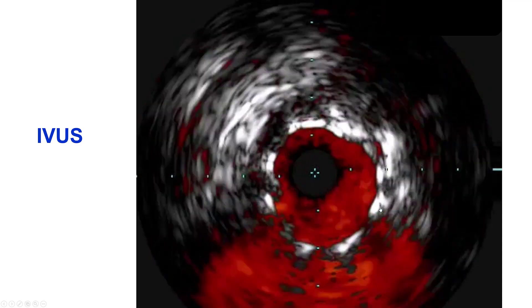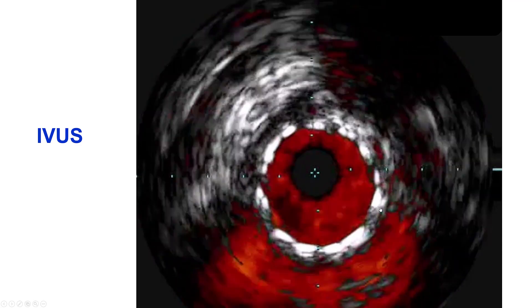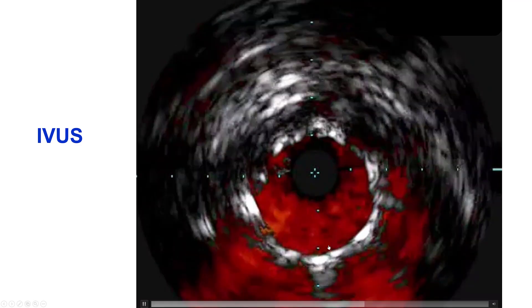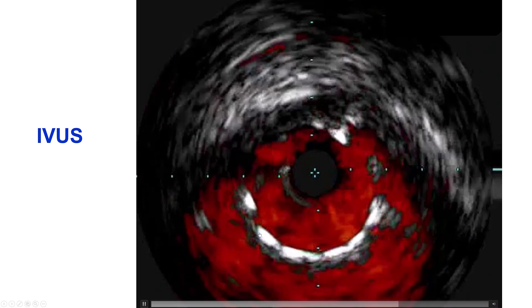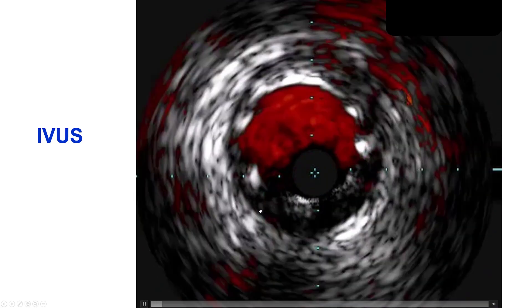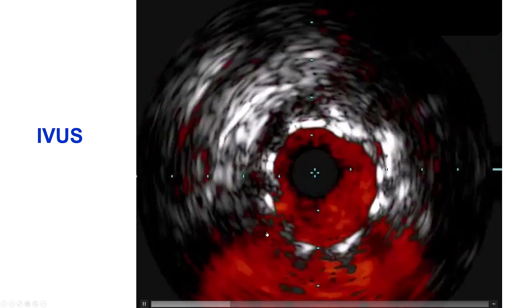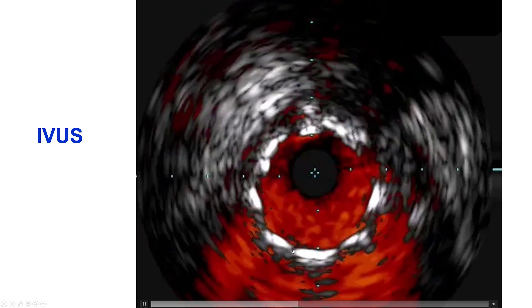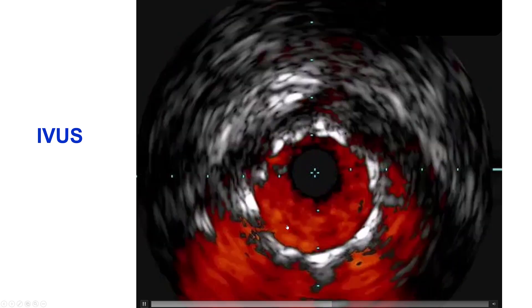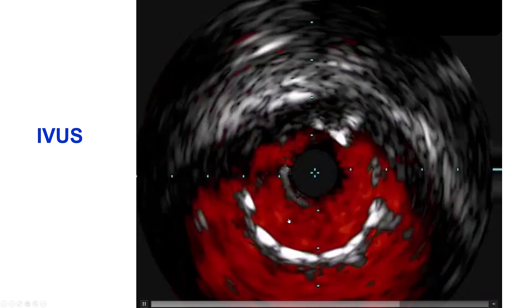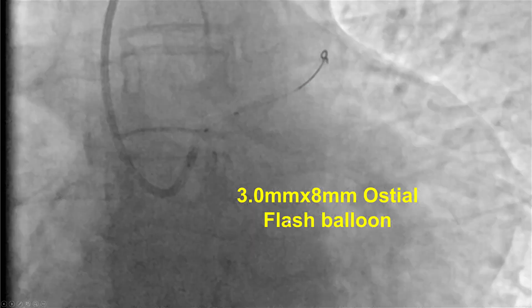As we do for all left main interventions, we performed intravascular ultrasound. This confirmed good stent expansion, and also that the stent was protruding essentially all the way into the aorta, with flow visible on both sides of the stent struts.